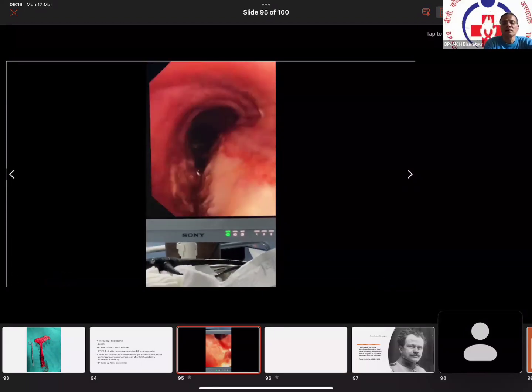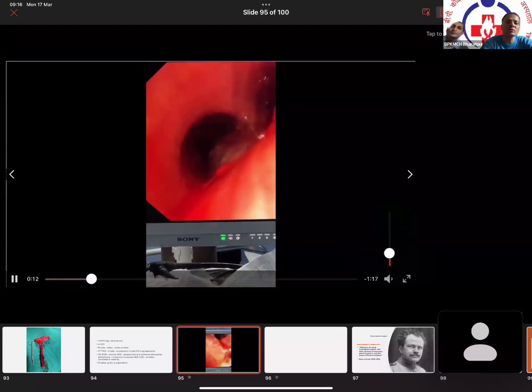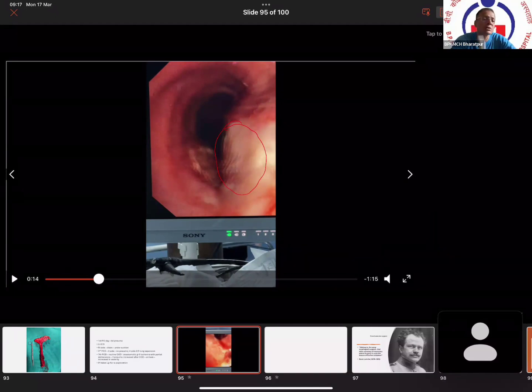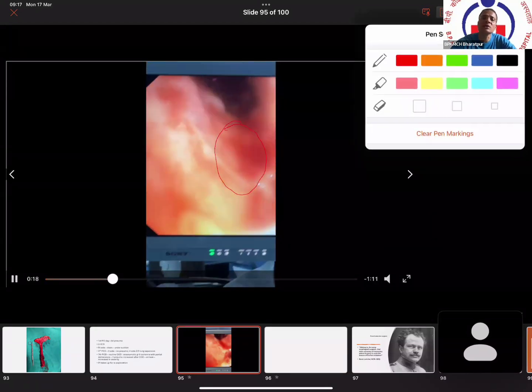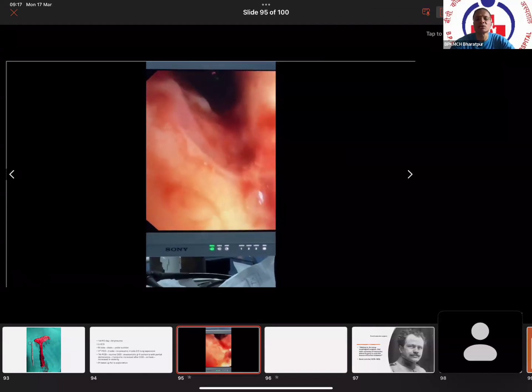And we did the bronchoscopy also. I will pause it. In the bronchoscopy, we can see something in the distal part of the trachea going towards the left main bronchus. But we did not realize it; we thought this could be because of the intubation. The patient might have some endotracheal injury of the trachea and left main bronchus. Though this was a single-lumen tube intubation, we just ignored it because we were not in the process of knowing what was happening with the patient. We didn't realize what the major issue in that patient was.